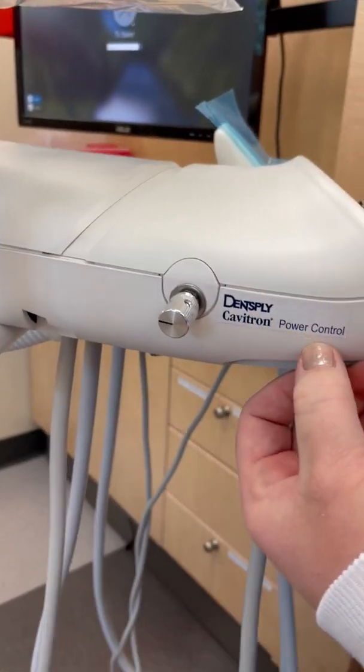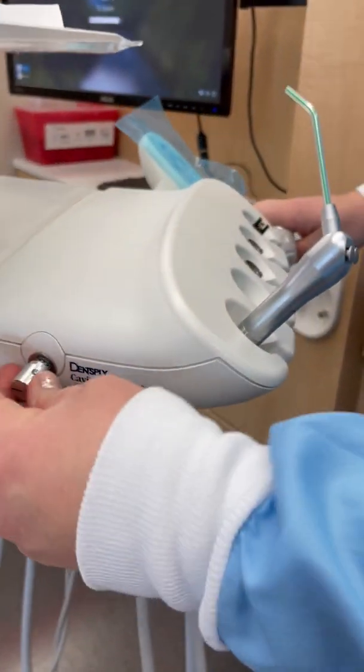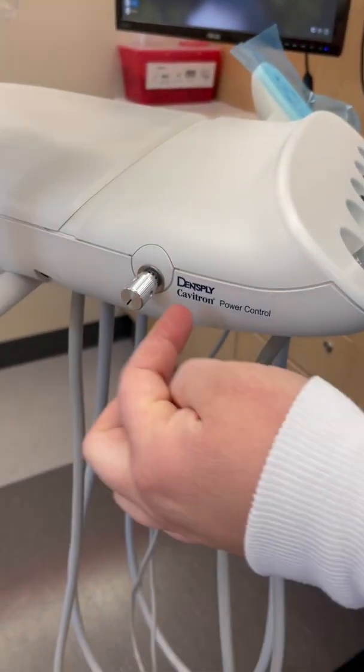This is the Cavitron power control, right there. Turn it all the way down at first.